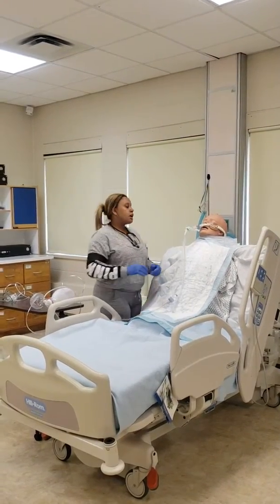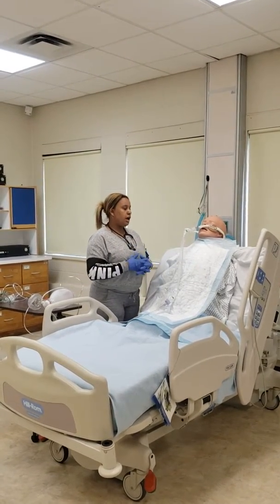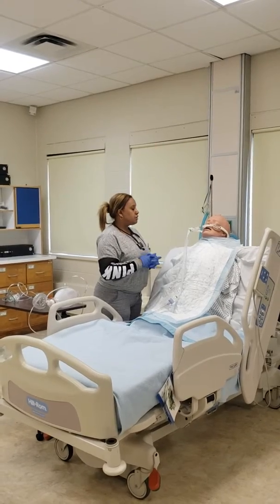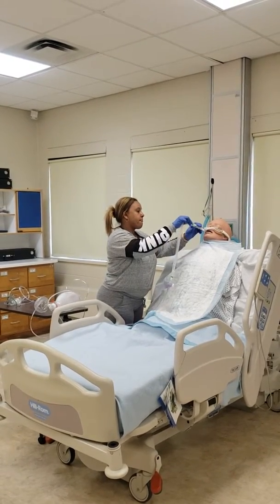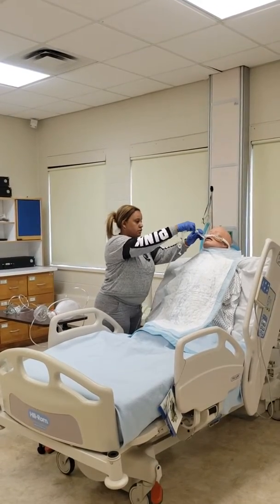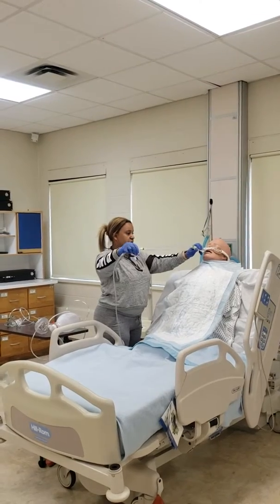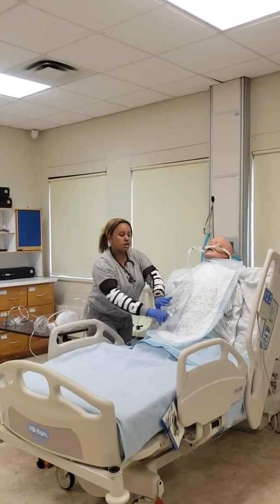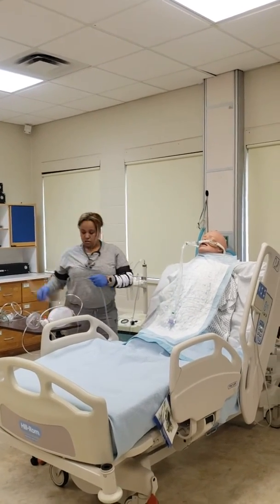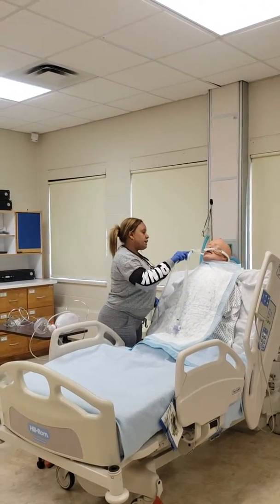I will pre-oxygenate the patient to 100% FiO2. I will now tell the patient, I will now be suctioning you, okay? 1 Mississippi, 2 Mississippi, 3 Mississippi, 4 Mississippi, 5 Mississippi, 6 Mississippi, 7 Mississippi, 8 Mississippi, 9 Mississippi, 10 Mississippi, 11 Mississippi, 12 Mississippi. I will now suction Mr. Jones.